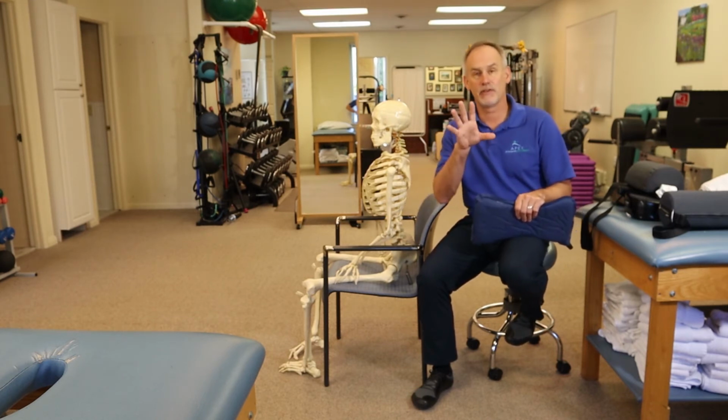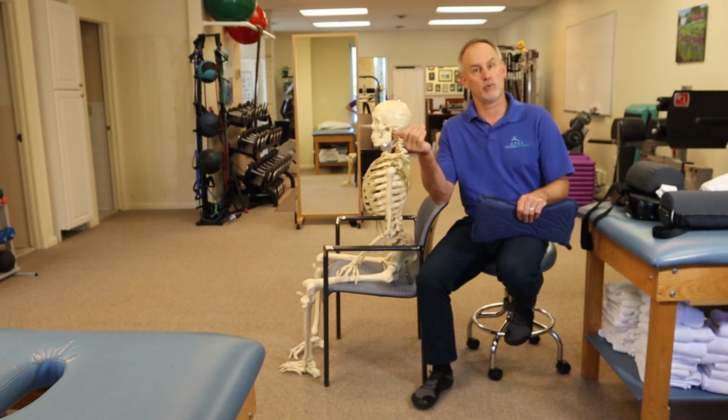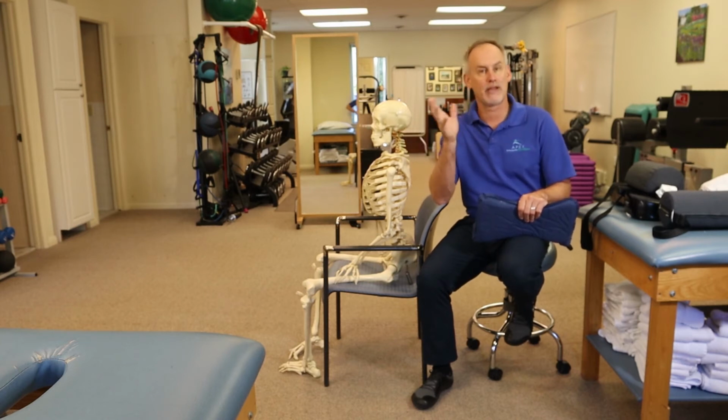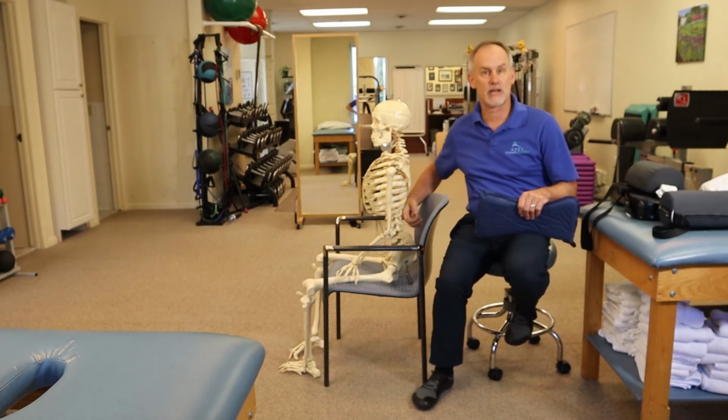These rolls should never feel bad. You should feel like this feels good, this feels comfortable. It feels better than when I'm not supported. So realize it's not a no pain, no gain. It should feel comfortable, but it shouldn't force you into excessive extension, just a little support for this natural curve.